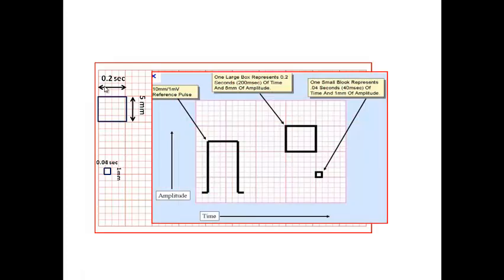Each signal can be assessed for both duration and amplitude using the grid squares. When commenting on an ECG we need to comment on P wave amplitude and duration, QRS amplitude and duration, T wave amplitude and duration — all of which have clinical significance. Now that we know the dimensions of small and large squares, we can measure any signal on the ECG paper.